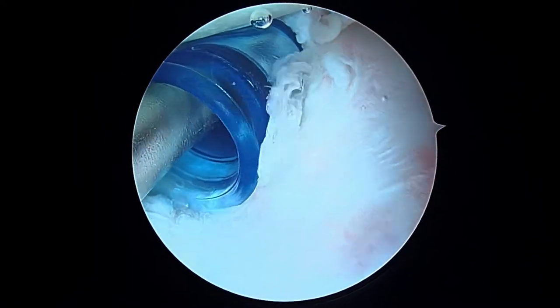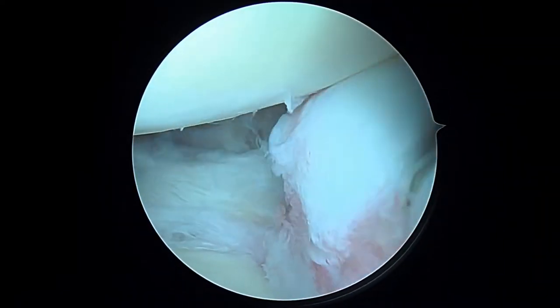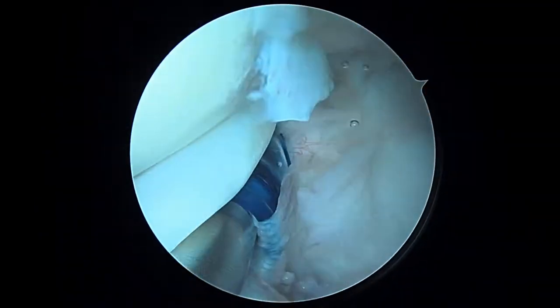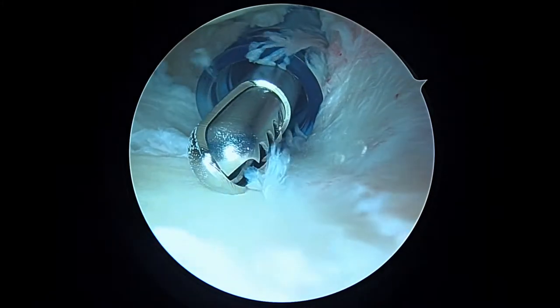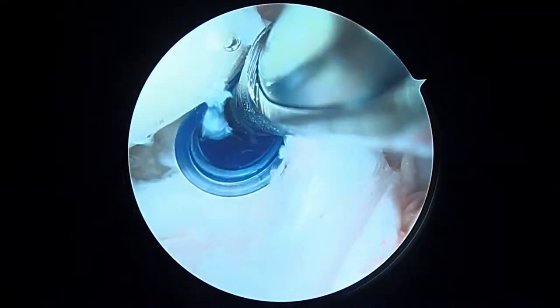As we look up here, the long head of the biceps tendon is right here, and it actually looks pretty good as it exits the shoulder. The rotator cuff tear is just behind it to the right — we'll look at that in a minute. As we look at the biceps and the biceps anchor, that's not bad at least not yet; I don't see anything too worrisome there.